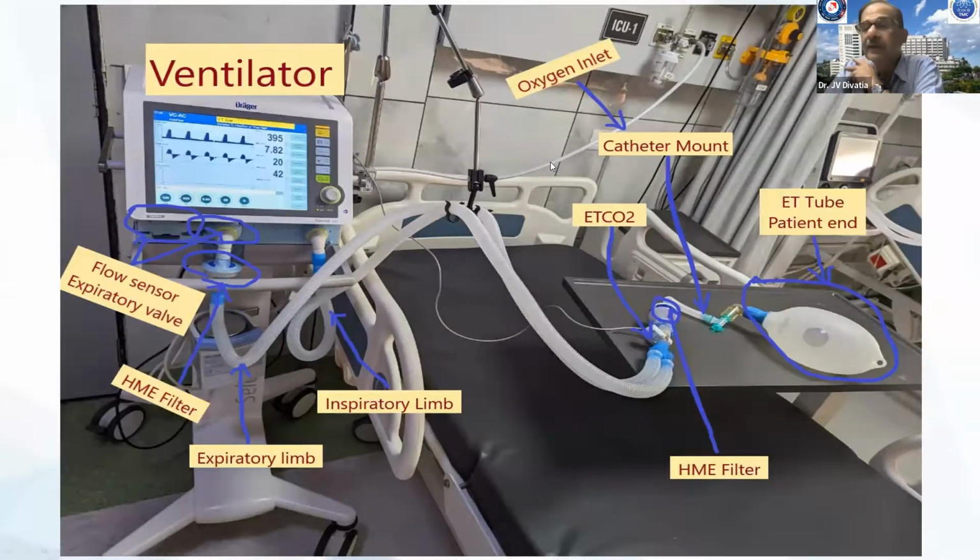Okay, if there are no further questions, guidelines for monitoring. So you can divide that into monitoring the ventilator itself and monitoring the patient on the ventilator, the other aspects, right? I don't think we should go into too much about other aspects like hemodynamics and so on, which you should monitor. But you want to talk about what you'll monitor on the ventilator itself?